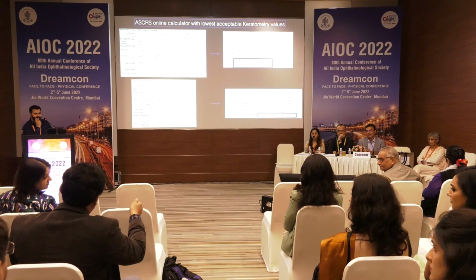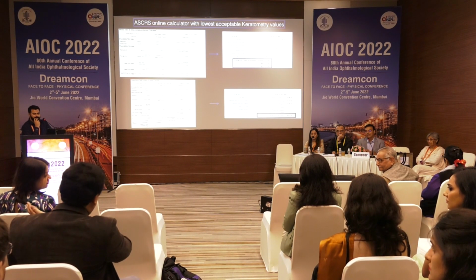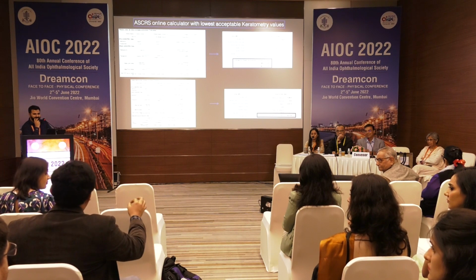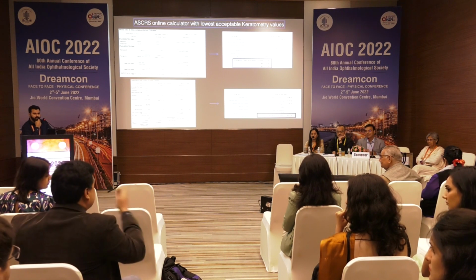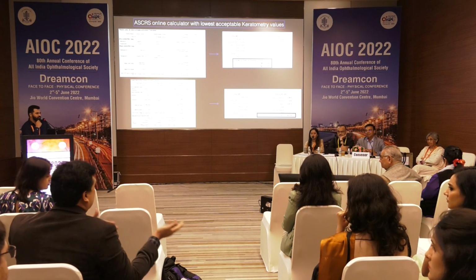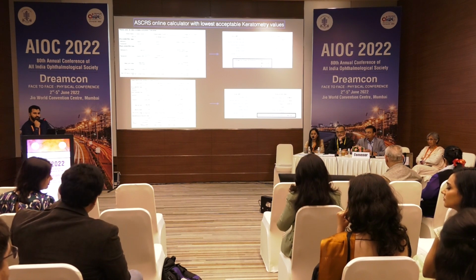So I did the intraoperative aphakic refraction, and as a first case, I did other cases. I didn't sit outside. Then I went outside and did the autoref, and then bang on it came. What you have to do is multiply whatever refraction you are going to get by 1.9, because there are different papers, some say 1.6, some say 2. So I multiplied it with 1.9, and I got it. That worked well. I think that's very useful.